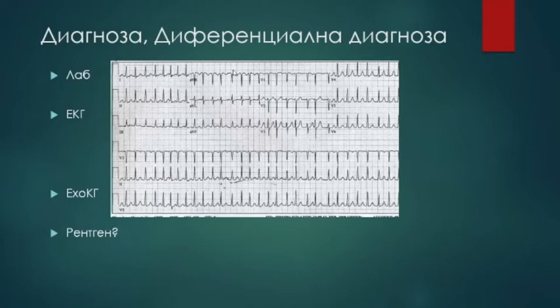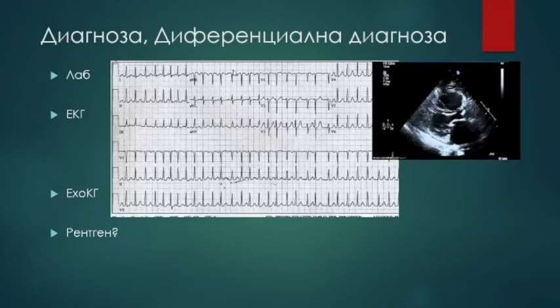So, I have to check the left atrium because of pathology of the mitral valve, as it is in here. This is a standard echo view, called the parasternal long axis view. Here is the left atrium. Here is the left ventricle. This is the aortic valve. This is the right ventricle. What we see here, you can't tell, but I can tell you that this is an enlarged left atrium. You have something here in the aortic valve, and you have an enlarged right ventricle. They are both enlarged because the mitral valve is thickened, and this is due to mitral valve stenosis.